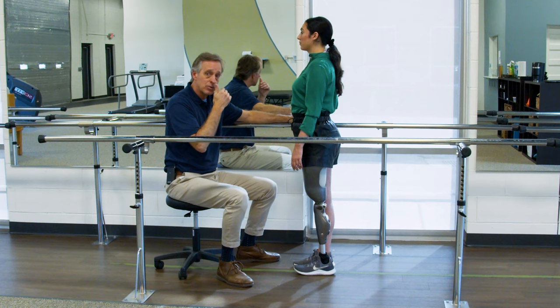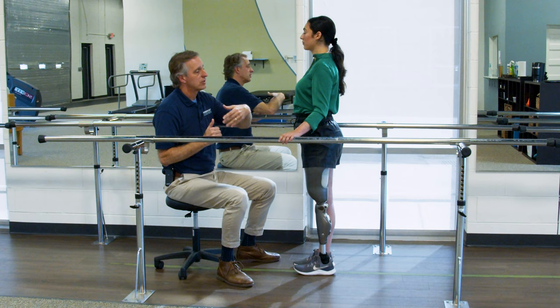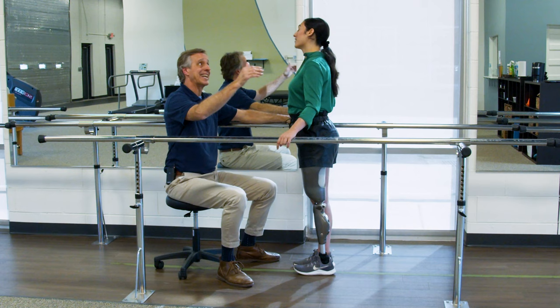And I say to Tracy, your normal step length is going to be a certain distance, your heel out in front of your other foot. All we want to do is accentuate that. So when you want to go a little bit faster, say you're crossing the street and the light's turning red, or green, and you want to get out of the street quickly. How do I do that? I don't know how to run yet.